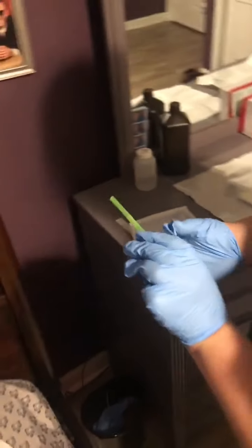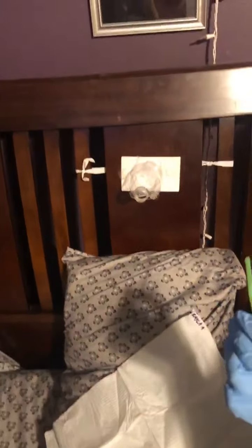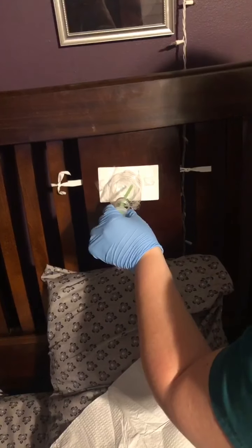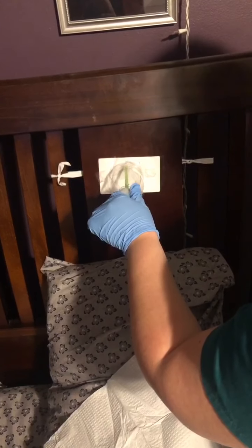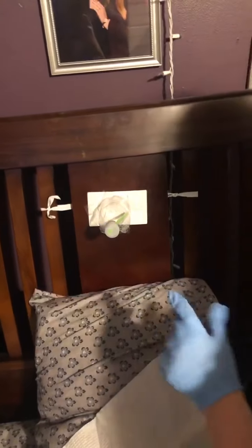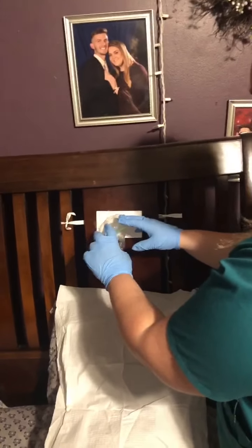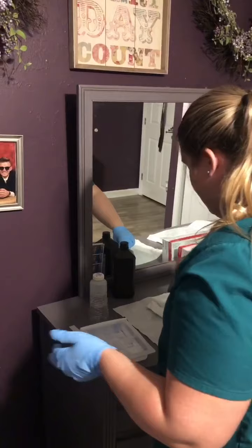So now I am going to remove the oxygen source, and I'm going to insert it at 9 o'clock, twisting it to 6 o'clock, and I would secure it and make sure that it's locked in, and then I'm going to reapply the oxygen. So now I'm going to remove the oxygen because I'm going to start cleaning the faceplate.